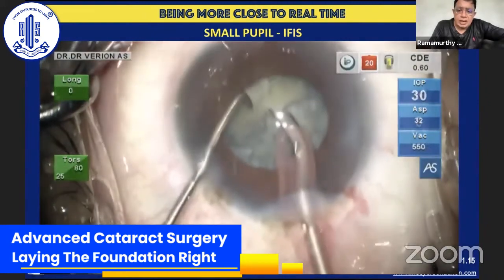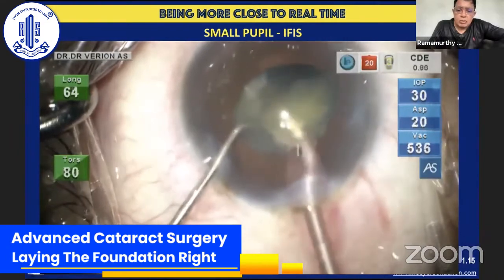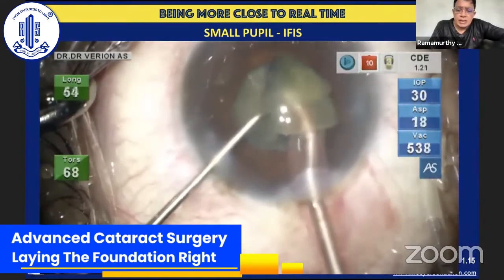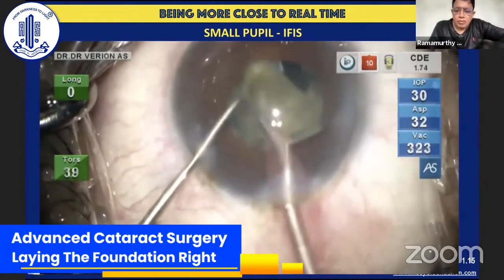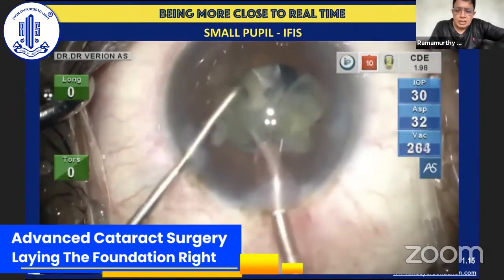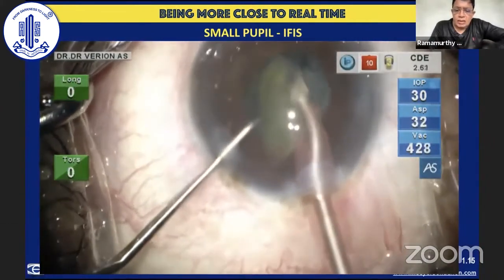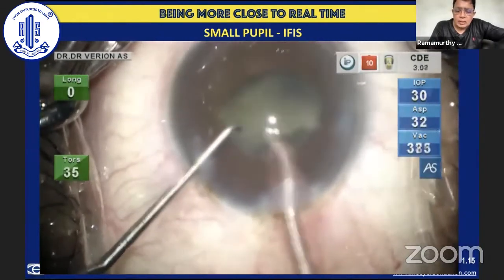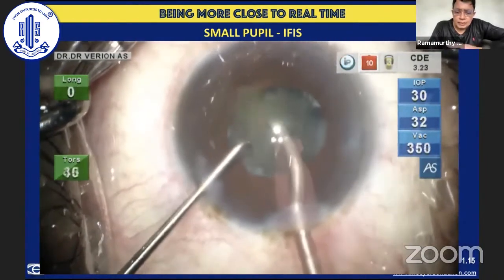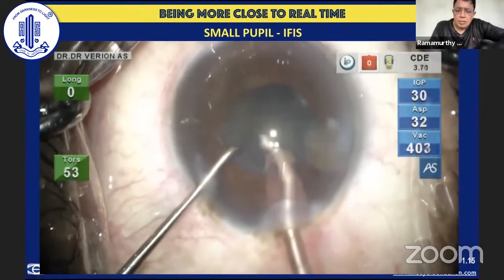And I find that with the right kind of parameters, you are able to do the surgery quite in a controlled manner. As you can see here again, the intraocular pressure is 30, where the bottle height is just about 41 centimeters. Aspiration remains at 32. I think vacuum is about 550 or 600 on the linear mode. And in spite of the pupil being small, you can see the intraocular milieu is quite stable. There's no fluctuation as far as the pupil is concerned.